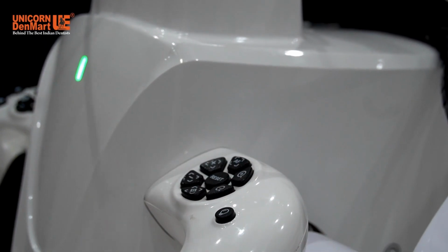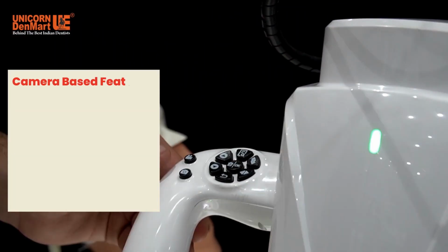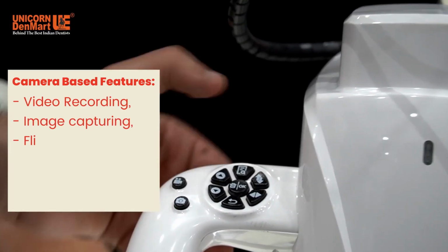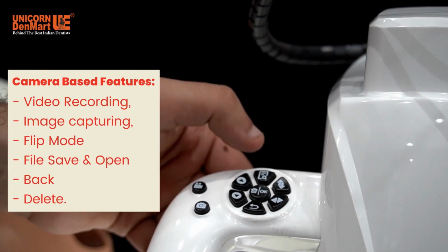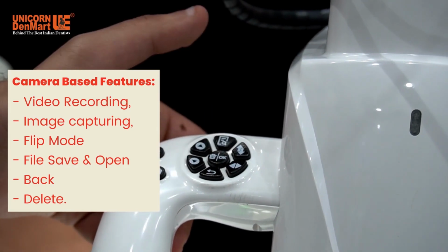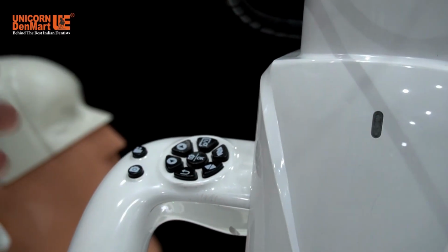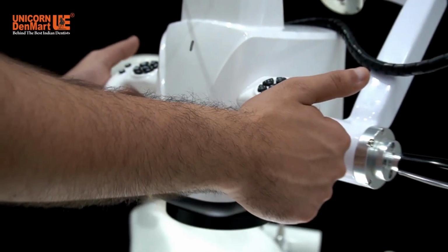Then on the left hand side, you will get all the camera based features. You can do video recording, image capturing, image flipping, right? You can do that too. If you want to save a file, move the file up and down and delete or press OK to save. You can do that too. If you want to go back, you can go back. You get all these functions in both armrests, in the operation handles.